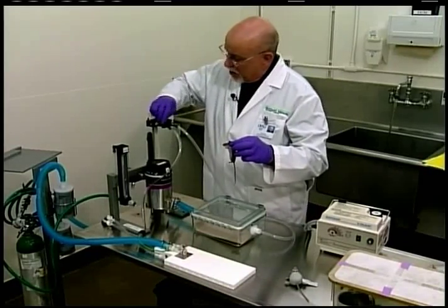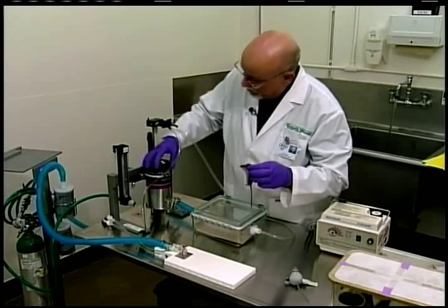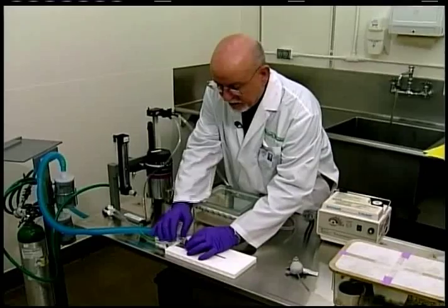I'm going to turn on my non-rebreathing system. I'm going to turn my vaporizer back on to 2.5% concentration, and I'm going to put my mouse into the non-rebreathing system here.